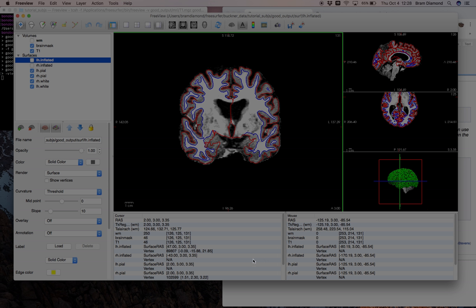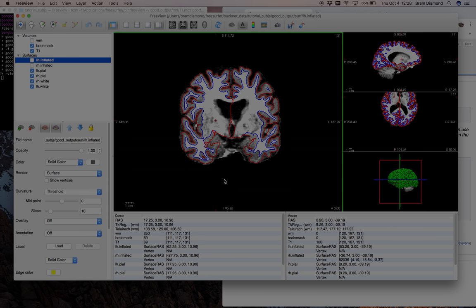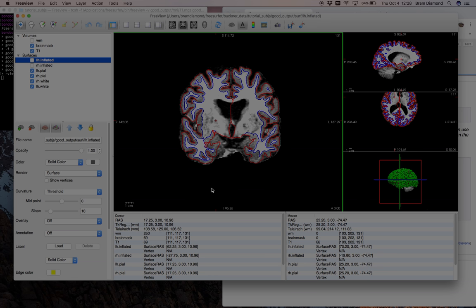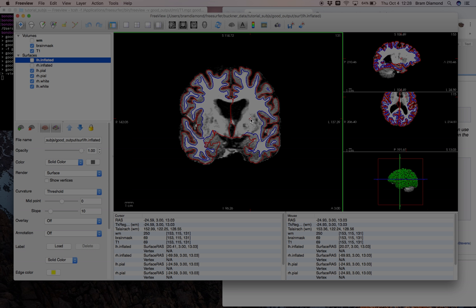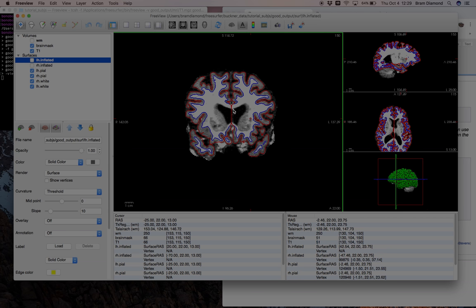Next we have the information panel at the bottom, useful for viewing information about each volume at the red crosshair or cursor position. If we move the red crosshair, we see the brain mask has an intensity of 69, and the coordinates in FreeSurfer space are 111, 117, 131. The right side shows the actual mouse position, changing as you move around. This is useful for copying or editing coordinates to report for a paper, or to quickly jump to a certain location — for example, typing coronal slice 150 and pressing enter will jump you there.